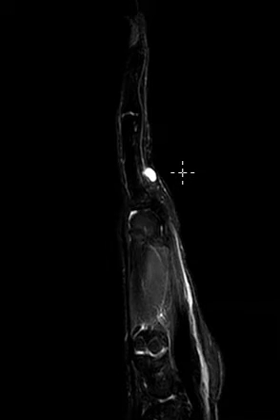The other things we can think about are an inclusion cyst or epidermal cyst, and that's where the epithelium gets infolded beneath the skin and a little fluid pocket will develop. And those usually hug the skin. Since they come out of the skin, they usually don't hug the tendon sheath like this. This is not a typical appearance. They can be a little bit more complex too. This is very uniform. And again, it doesn't look like it comes out of the skin so much as it comes out of the tendon sheath.